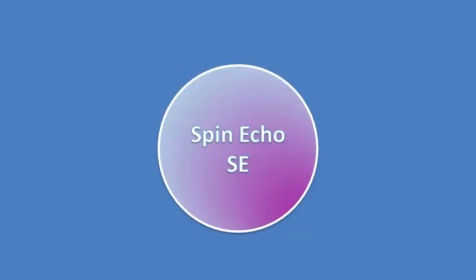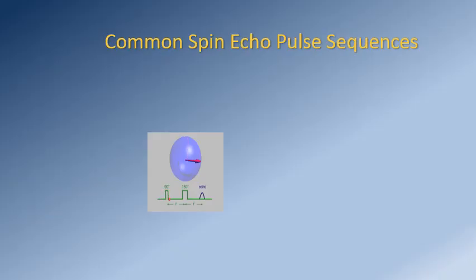So let us start with the first family, spin echo sequences, and discuss in detail the commonest sequences we can deal with in clinical practice. There are two main pulse sequences present in almost all MRI studies.